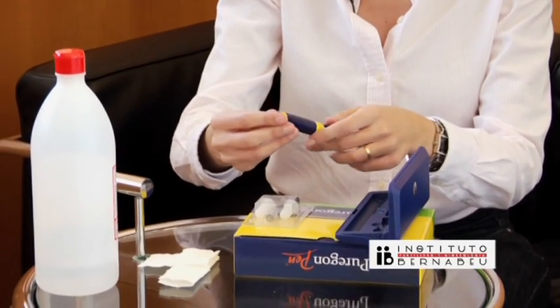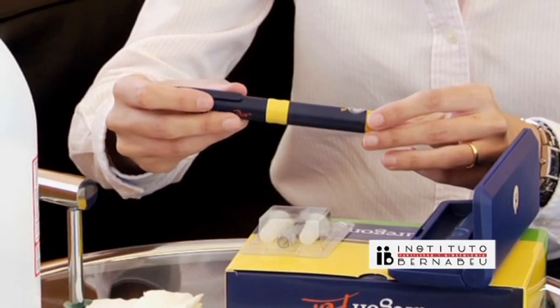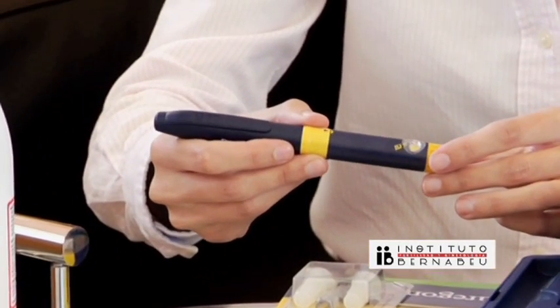The pen has units on the right-hand side. These international units are what you must select, based on the instructions given to you by the doctor overseeing your treatment.